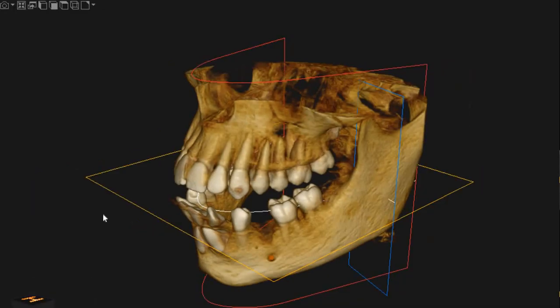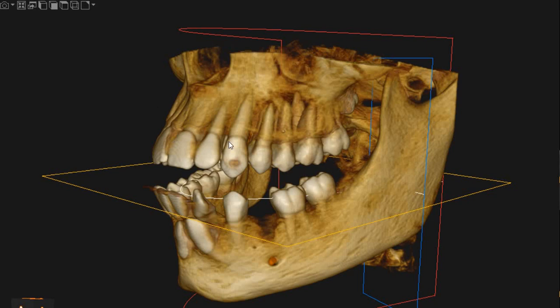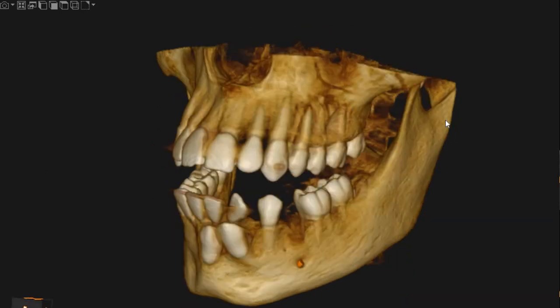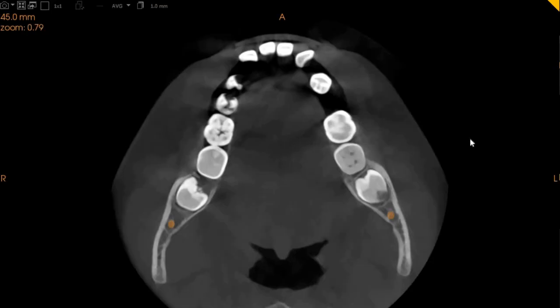Assalamu alaikum, Ultraskan Diagnostics here. This is the CBCT of the patient that you had requested. The area of interest is the lower anterior region for the impacted teeth that we can see right here.